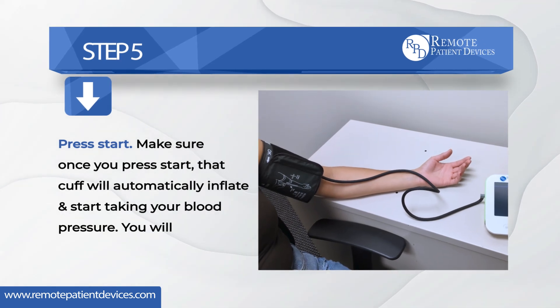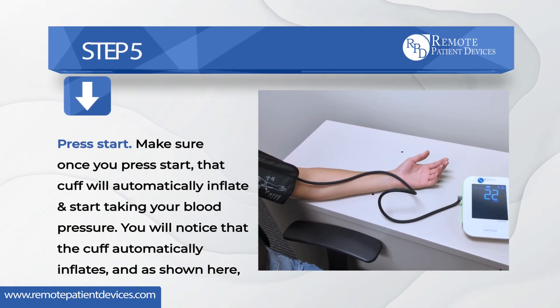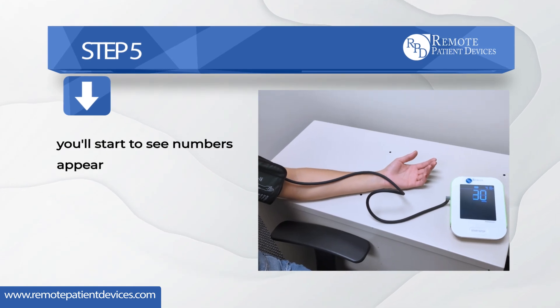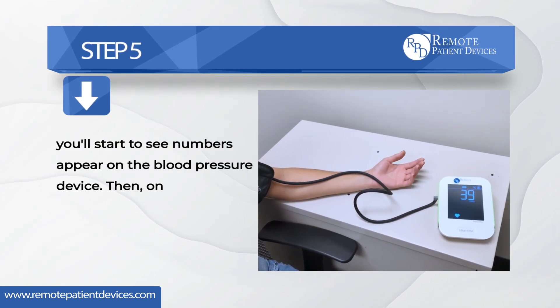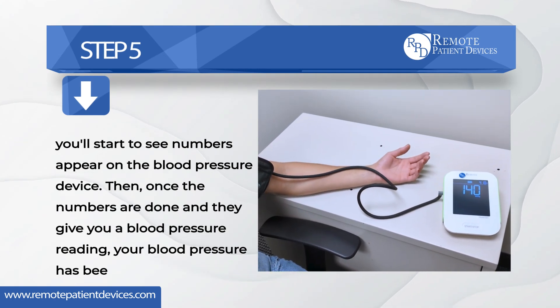You'll notice that the cuff automatically inflates, and as shown here, you'll start to see numbers appear on the blood pressure device. Once the numbers are done and they give you a blood pressure reading, your blood pressure has been taken.